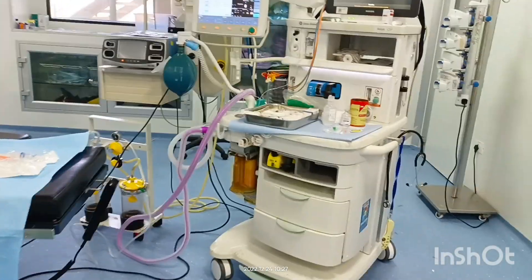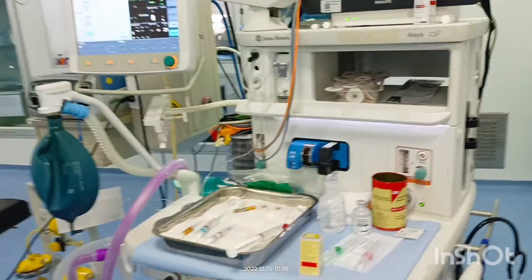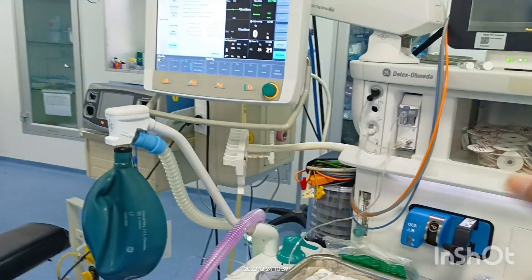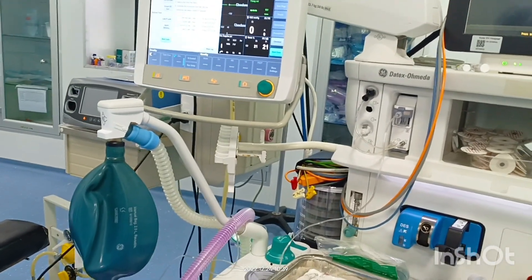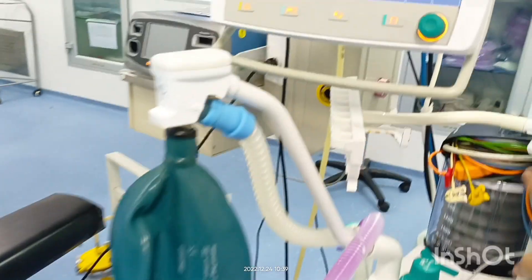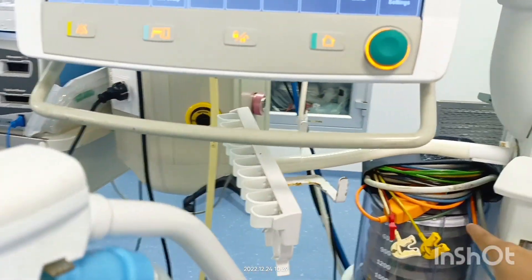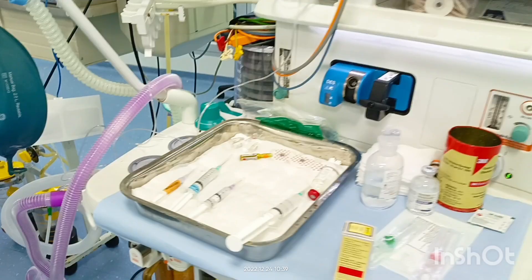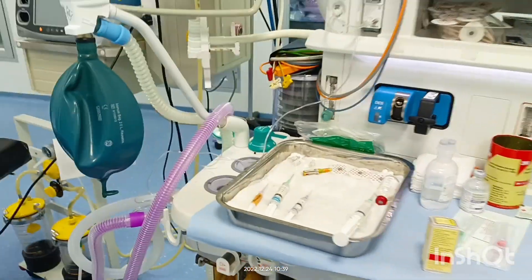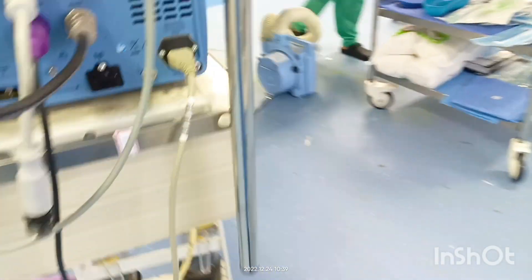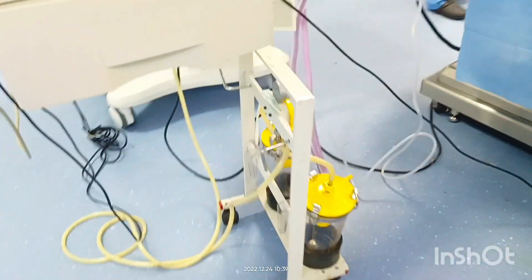Next I will show you the anesthesia machine. This is the anesthesia machine, and we should keep these monitors ready — to end the case and for when the patient comes to start the case. These are the ECG, BP, and pulse oximeter leads which we connect to the patient. These are all the drugs we should keep ready alongside the anesthesia machine.